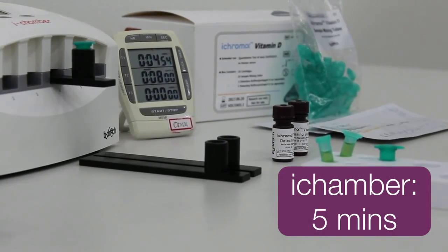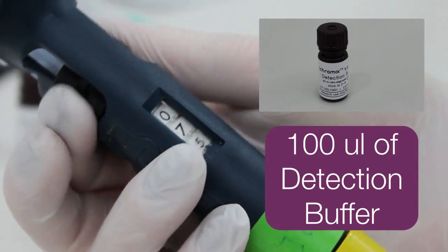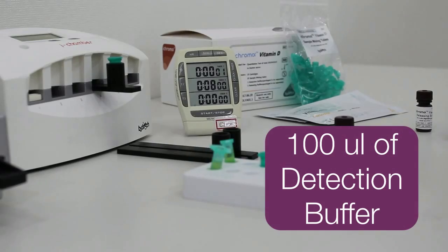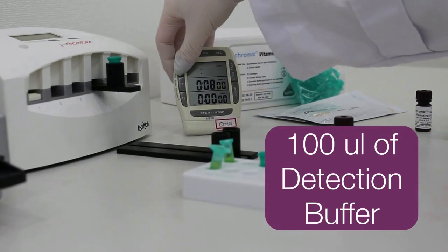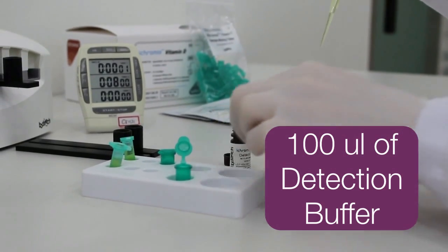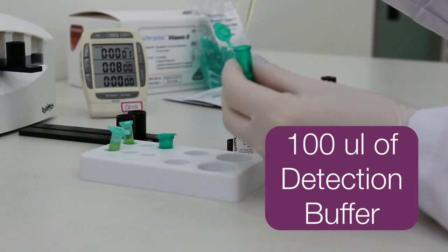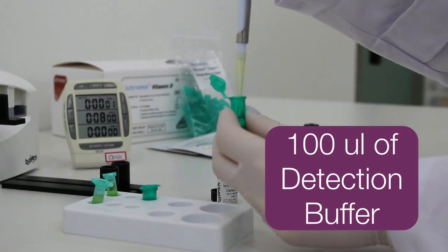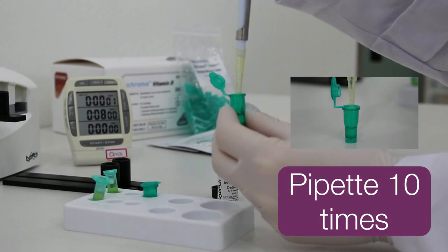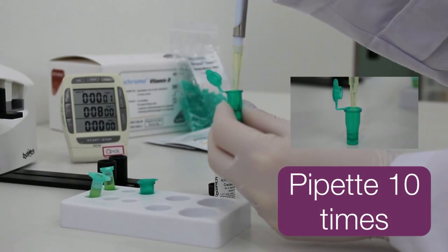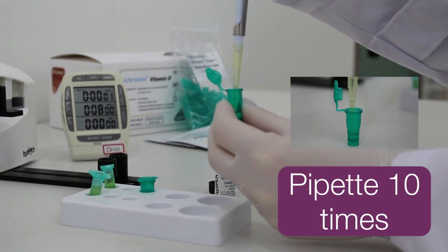After 5 minutes, add 100 microliters of detection buffer using a new pipette tip to the tube containing the releasing buffer and sample mixture. Mix well by pipetting 10 times and leave it in the incubating tube block again at 35 degrees Celsius for 15 minutes.